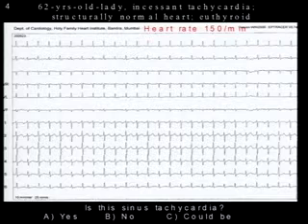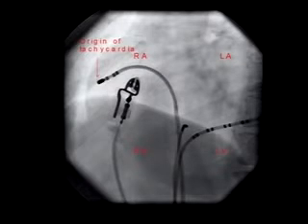In fact, can we go to the next slide? So the correct answer was atrial tachycardia, because in the algorithm in the talk on narrow QRS tachycardia, it's pointed out by Sriram that if you have a P wave preceding the QRS, the most likely is atrial tachycardia, especially with a positive P wave in lead 2. Now this shows the 4 chambers of the heart in the left anterior oblique view, and the catheter and the arrow shows this is where it was found that the tachycardia was originating from.